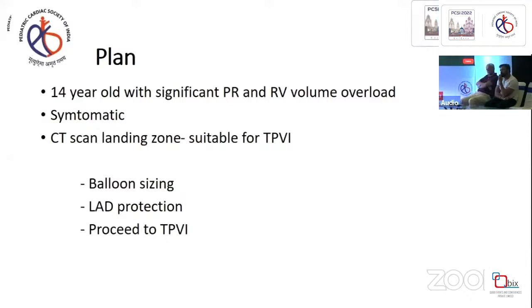Why I use the pacing catheter in the LV here is that pacing is a very crucial point of the deployment of this valve, because the valve should not move. So I tend to push in the LV. Sometimes when you have it in the RV, when taking the big sheath across, it will pull this entire thing off. So I always have an LV pacing catheter.